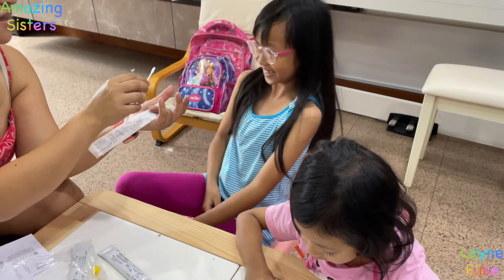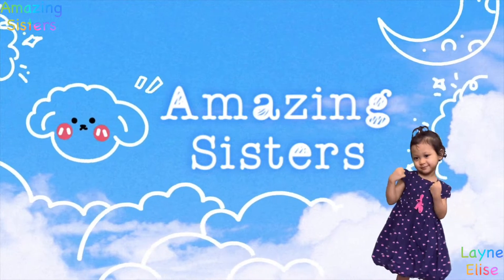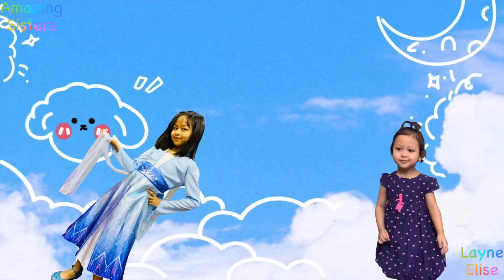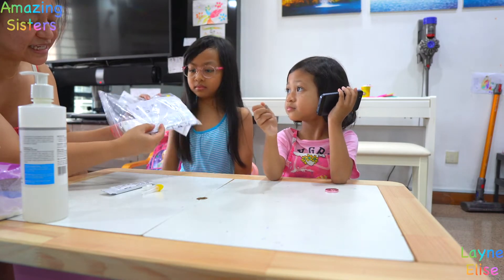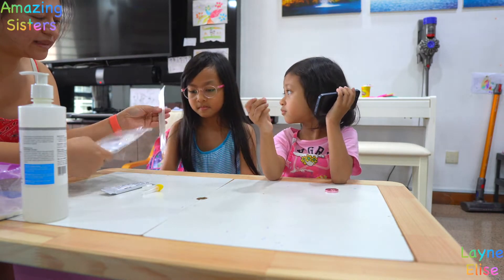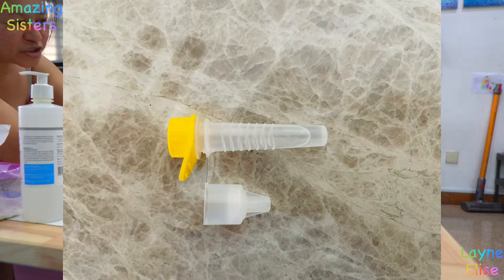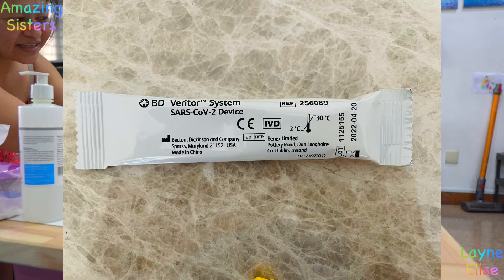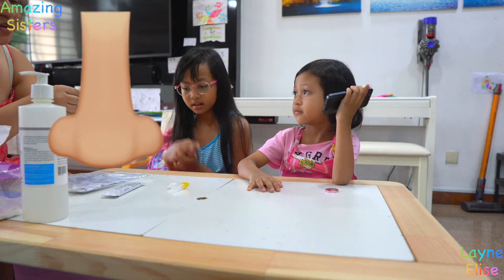I'm going to take a look at it. So we're preparing the kit. One test needs one swab with the liquid solution and the kit — that's all. And your nose has it, and then we need her nose.